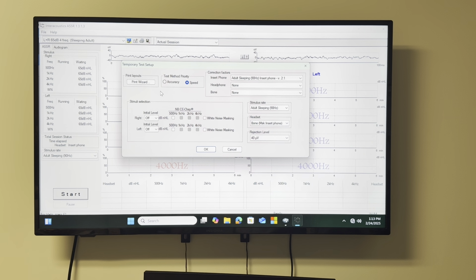So we're gonna play some noise. Let's play at 50, it may be too loud for him. That's the left, then the right, and we put masking. You have only white noise. In the audiometer, the noise is calibrated at effective masking level. That means if you play effective masking noise at 70 against a tone at 70, that masks out the tone, that's like the threshold.